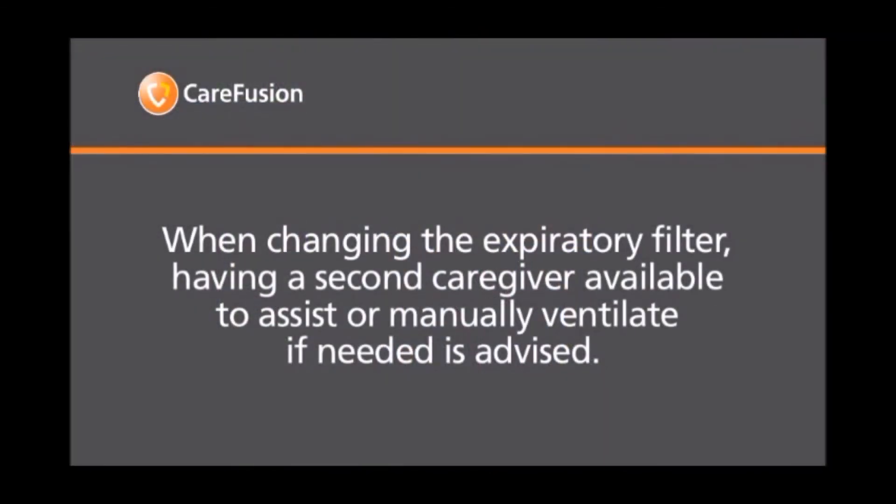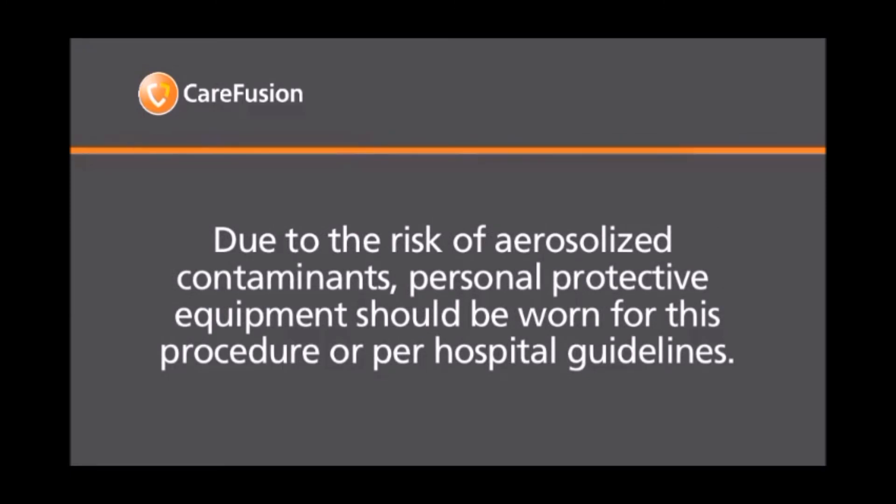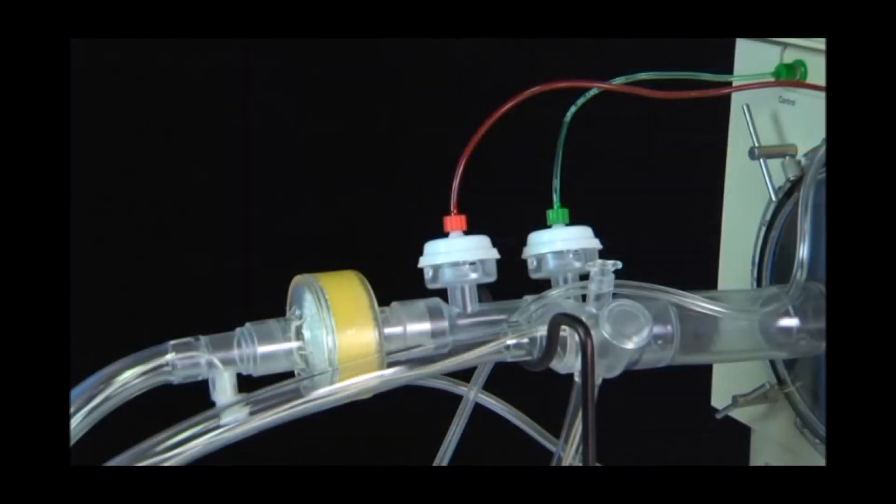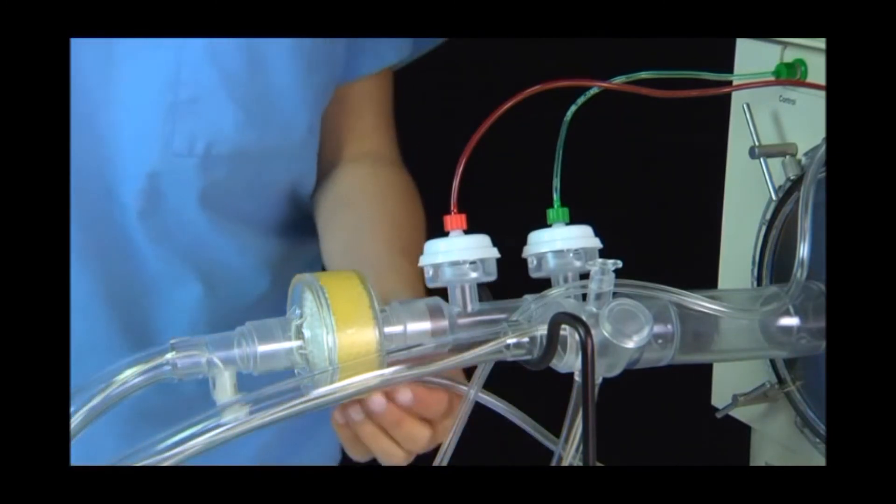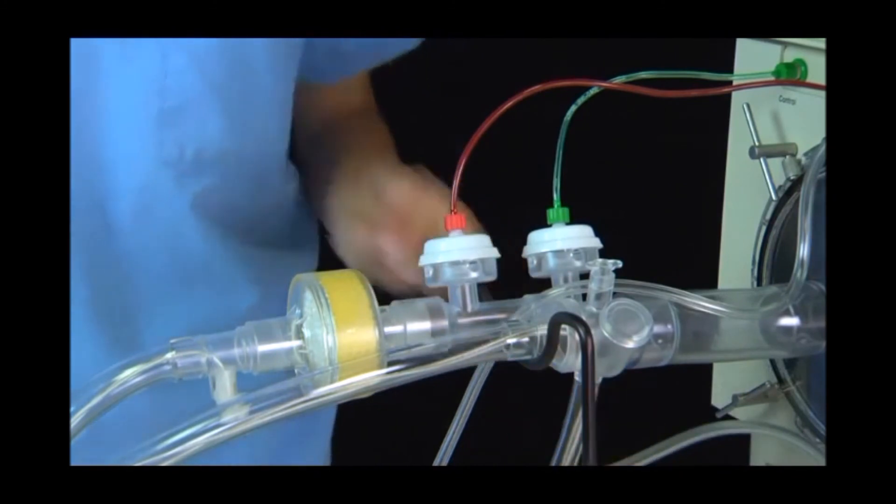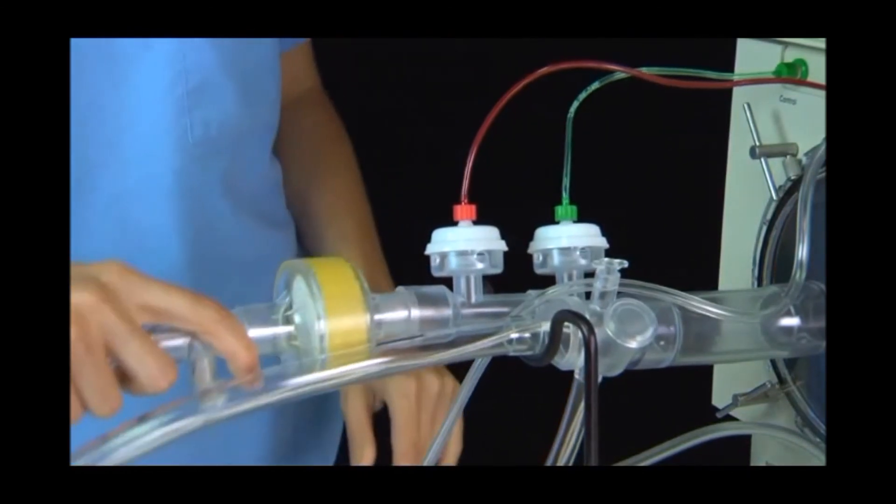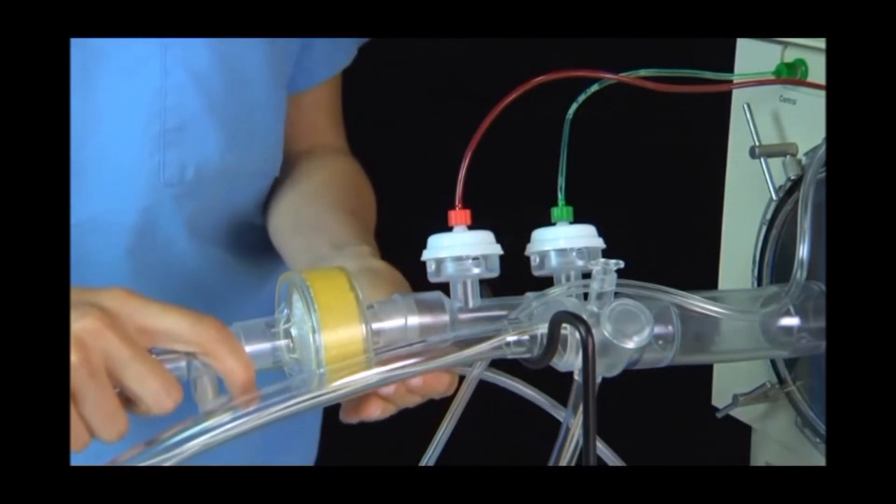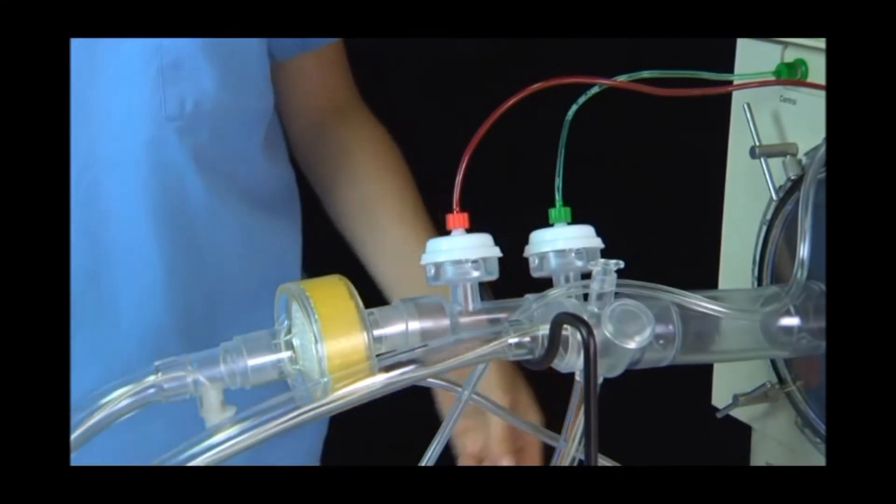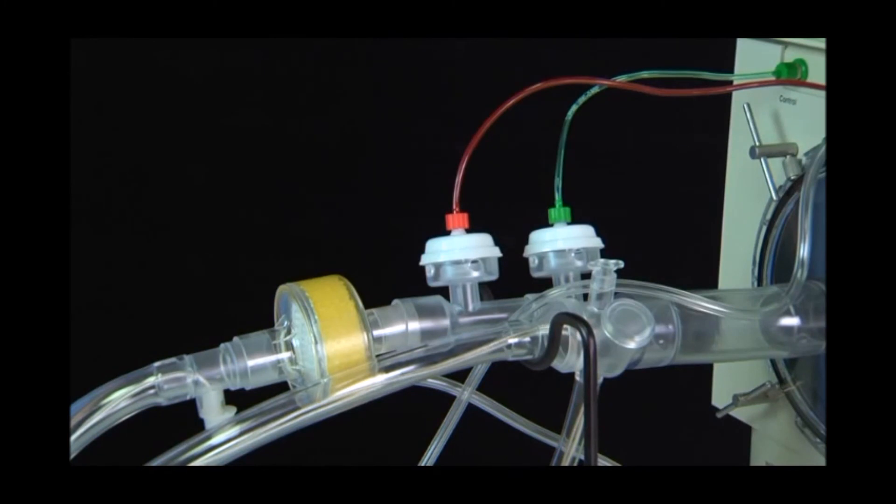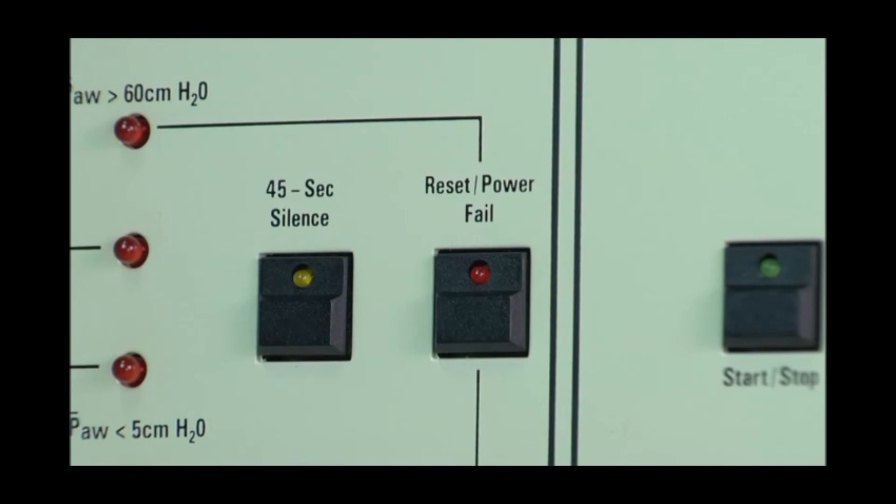When changing the expiratory filter, having a second caregiver available to assist or manually ventilate if needed is advised. Due to risk of aerosolized contaminants, personal protective equipment such as gown, gloves, masks, etc. should be worn for this procedure or per hospital guidelines. Prepare the new filter by removing it from its packaging and place in an accessible place such as on top of the 3100 or a bedside tray. Disconnect the water trap drain tubing from the lure fitting on the bottom of the filter. Carefully disengage the filter from the circuit and set aside. Place the new filter in the circuit. Reconnect the water trap drain tubing to the lure fitting on the bottom of the filter. Ensure all connections are hand snug, but do not over tighten. Reconnect patient if needed. And deep press the reset button to pressurize the circuits and resume ventilation.